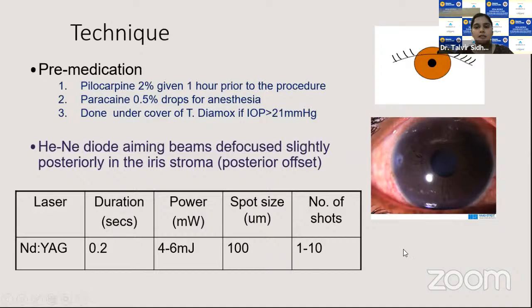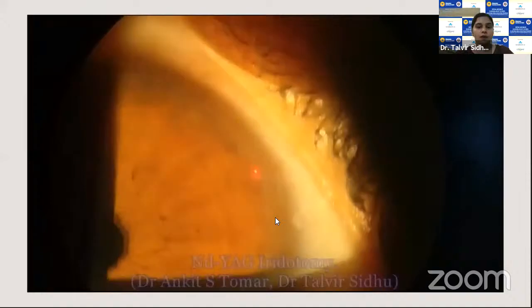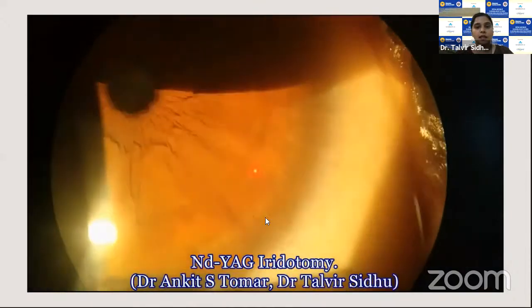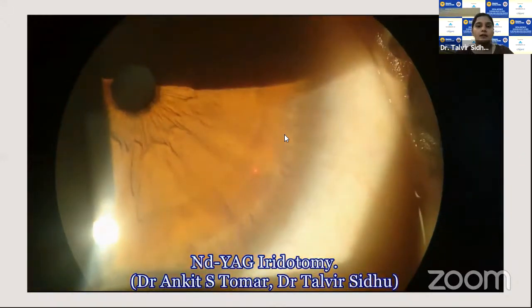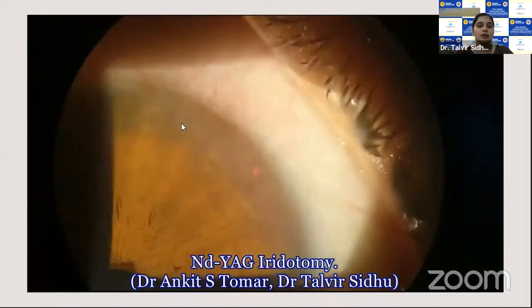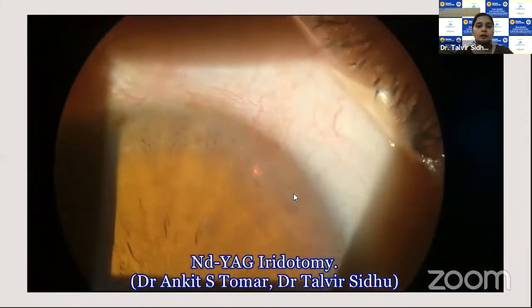So multiple settings might be needed while doing a PI. This is a video of doing a PI where you first see and select the site of the PI. Here I'm trying to see where the iris is thin enough to do a PI. And in the superior part, you see multiple crypts over here.